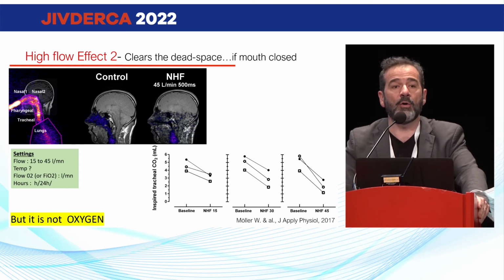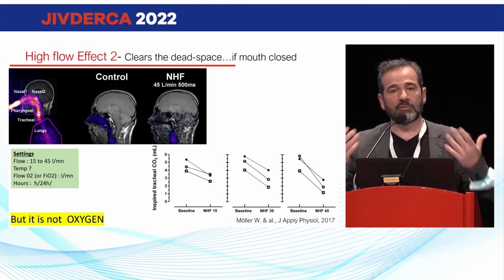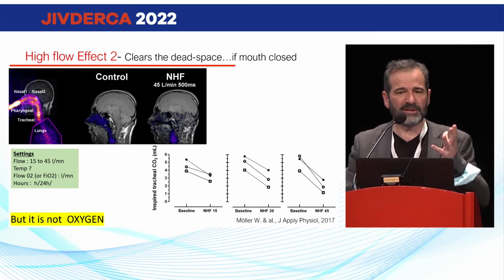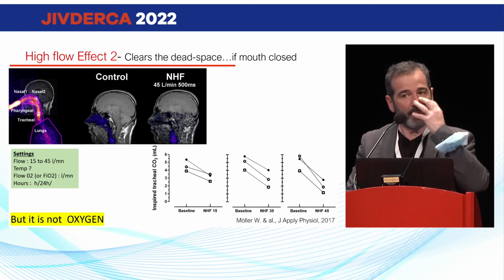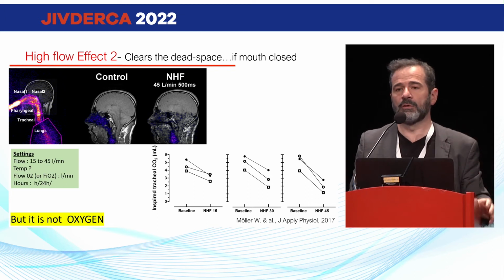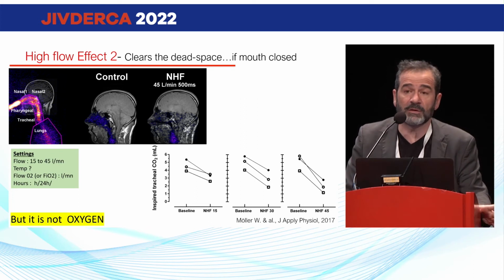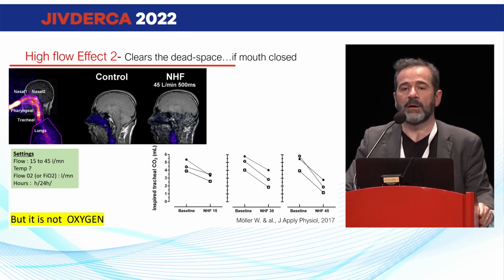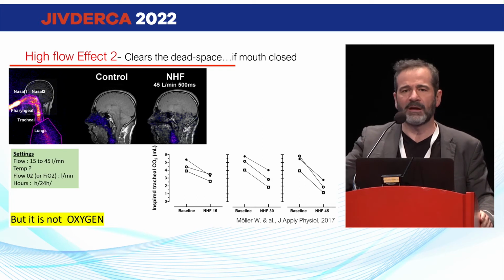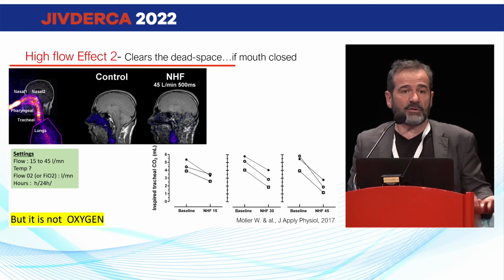And this study also that you have seen during these 3 days with a beautiful picture showing that you wash the CO2 in the upper airway, it's true. If you use any flow, even hyperventilation, if you use any flow in the upper airway, you are going to wash the CO2, and you are going to decrease mechanically the PCO2 of your patients. So as you send flow in your upper airway, it was not oxygen and it was not written if it was humidified or warm. If you send flow to the upper airway with any type of device, ventilator, CPAP, even a fan, or exercise with hyperventilation, you are going to decrease the PCO2. Yes, it's physiology, it's logical.